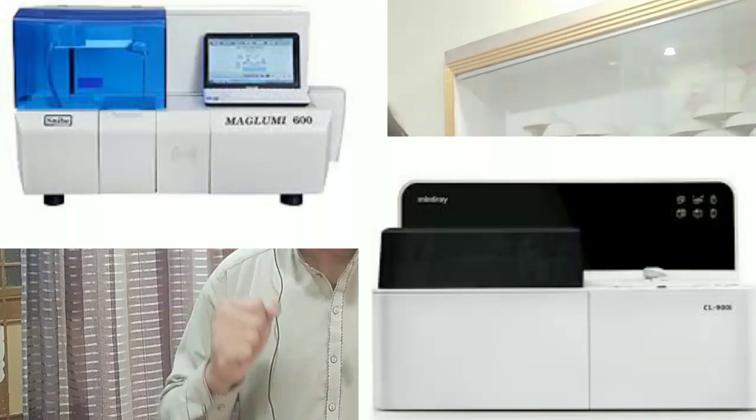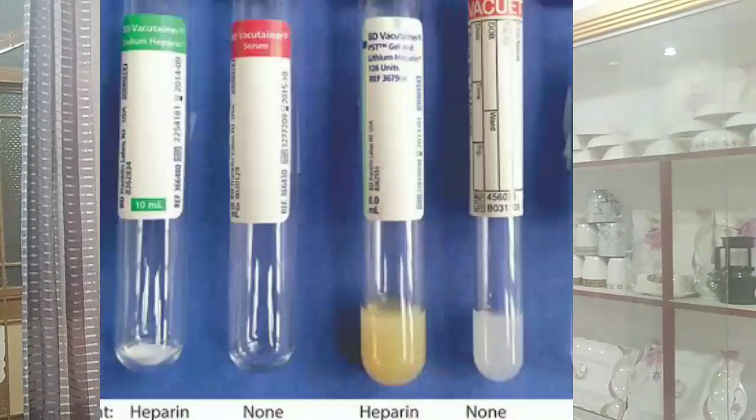Next, for the prostate specific antigen you need blood in a gel tube or red top, or lithium heparin, or we can say green top as well. So this is the blood that you must take in each tube. Then you will centrifuge it to get the serum or plasma. Then you will run the test. Okay, so this is the procedure.